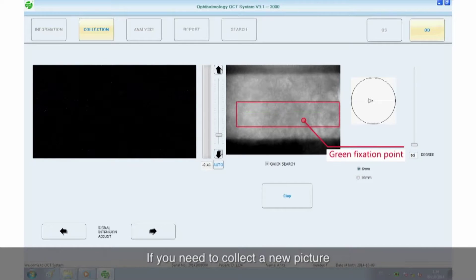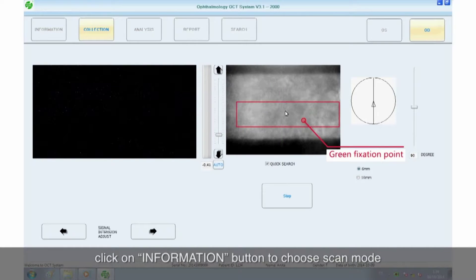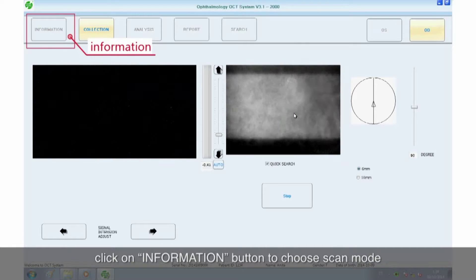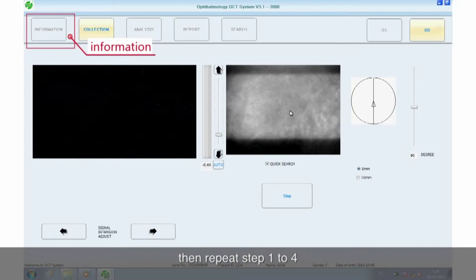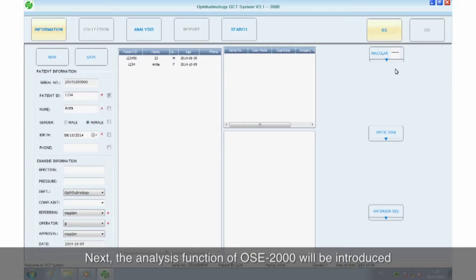If you need to collect a new picture, click on Information button to choose scan mode, then repeat steps 1 to 4. Next, the analysis function of OSE 2000 will be introduced.